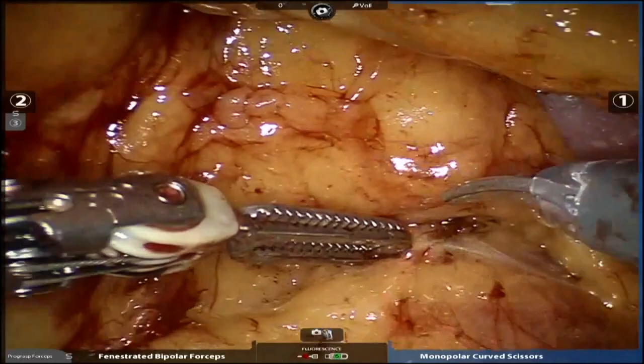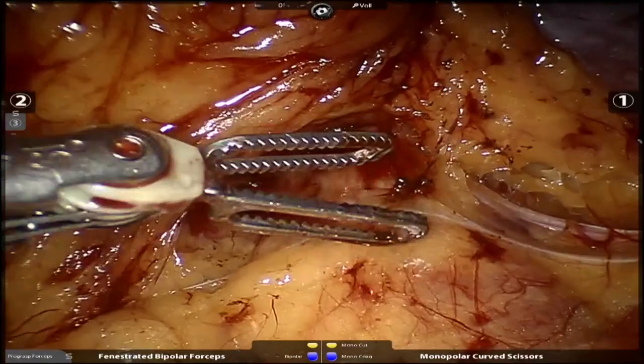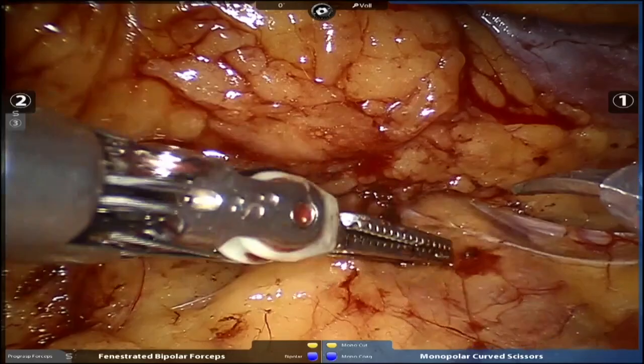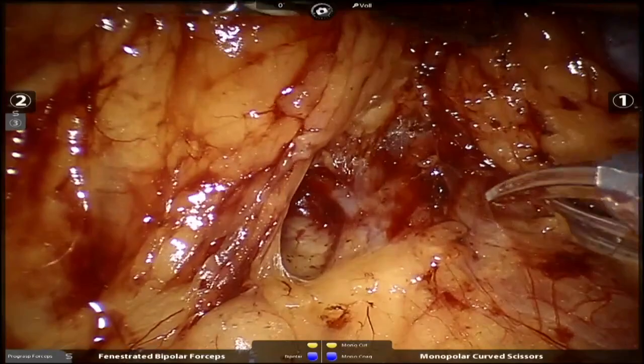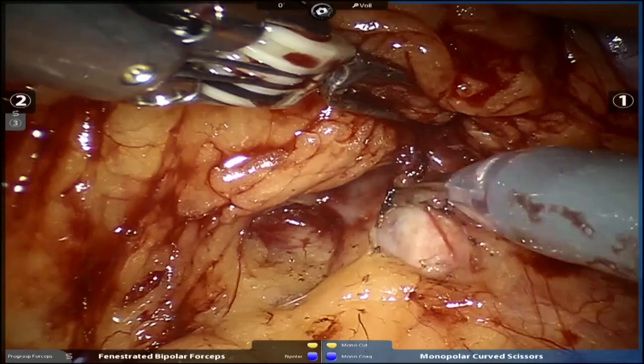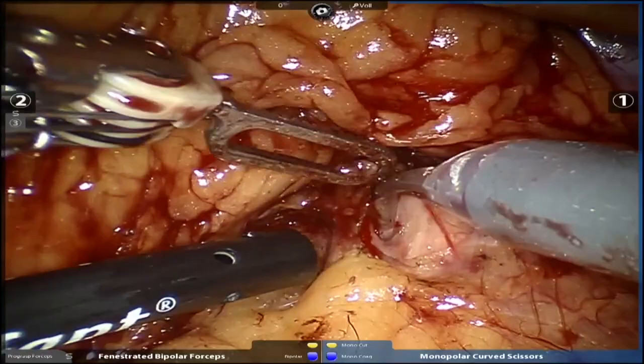I think it's nice this case is on the left side, so you don't have to worry about the cava, but you're obviously more circumspect and careful on the right side because of the cava in this location, aren't you? I think the cava is a nice landmark. The nice thing about the cava is we know the artery is going to be behind it, so I don't think we're any more careful. You know, the aorta's near here too. I think around the hilum, we're going to be super careful no matter what side. But the cava is nice because once we see the cava, we know the artery is going to be just behind it.